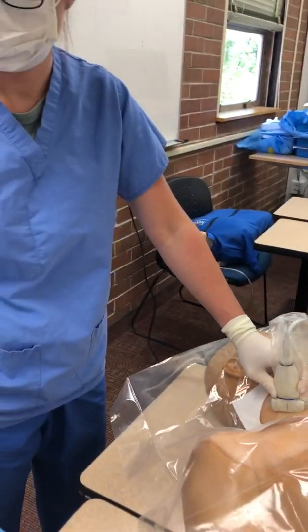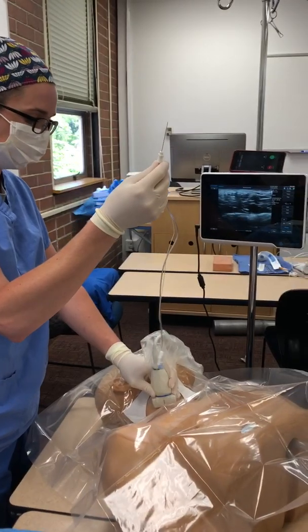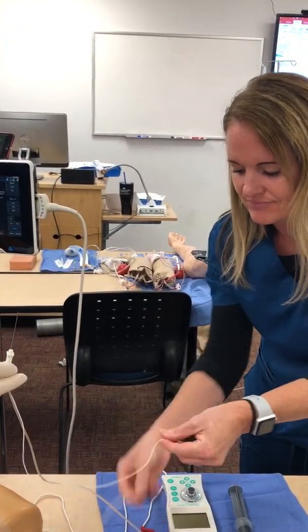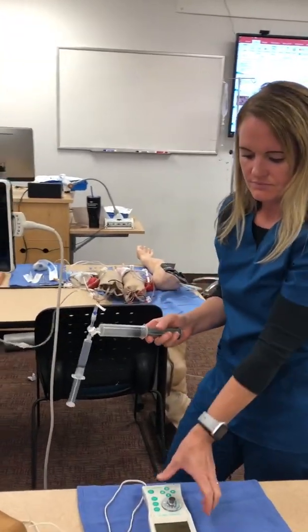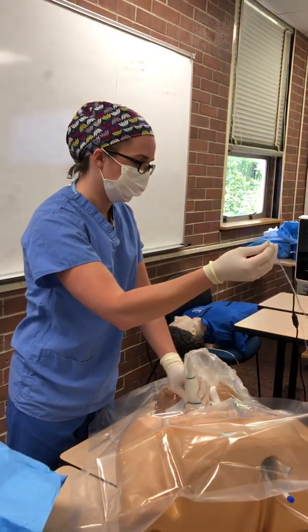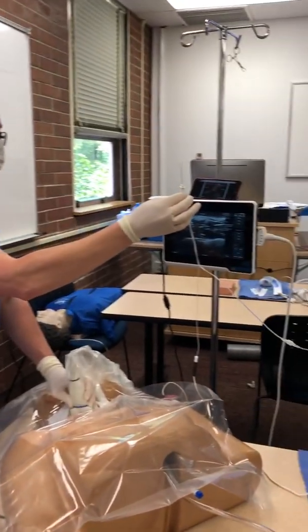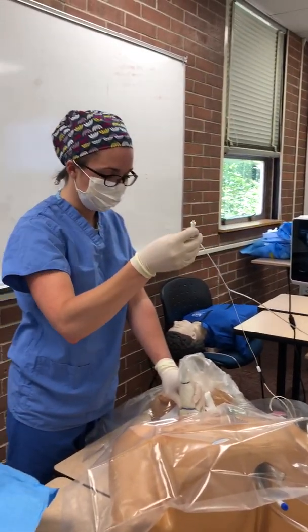and at this point I go ahead and get my needle out. Again, that's a 22 gauge needle. It's 2 to 3 centimeters long. And if you don't mind, I already drew up about 40 mLs of local anesthetic. What we would use would depend on the facility. There's many different things, but for this case, let's say it's 0.25% Marcaine, and it has 4 milligrams of dexamethasone in it. So we'll go ahead and flush the line with a little bit of that, just so we don't have any air in that line. And then we have it hooked up to the nerve stimulator as well.